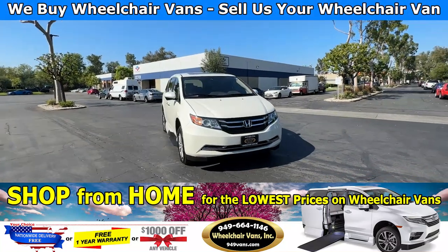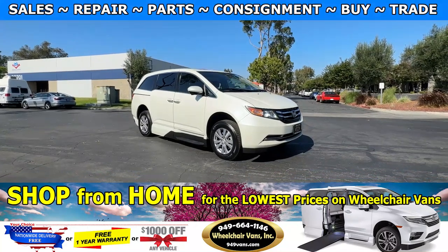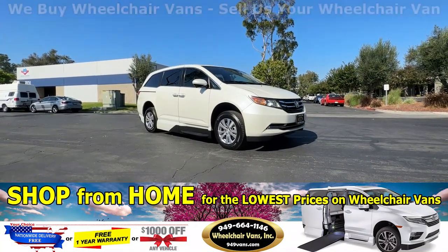Hello and welcome to Wheelchair Vans Inc. Today I'll be going over a 2015 Honda Odyssey equipped with the VMI North Star in-floor ramp.